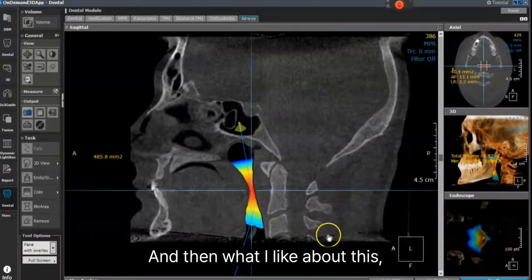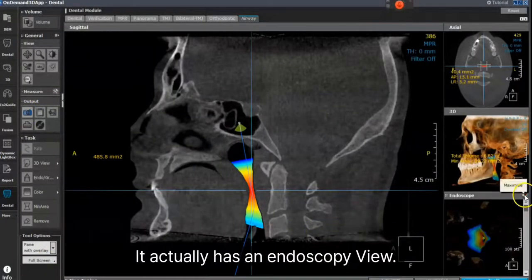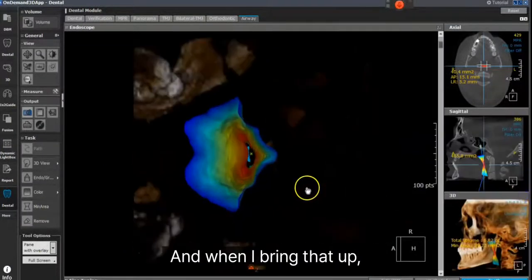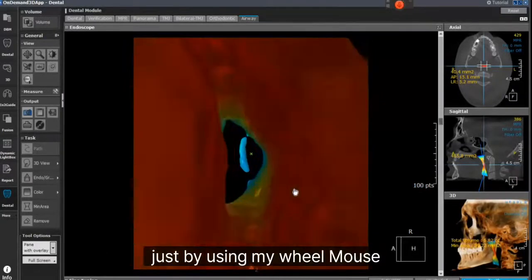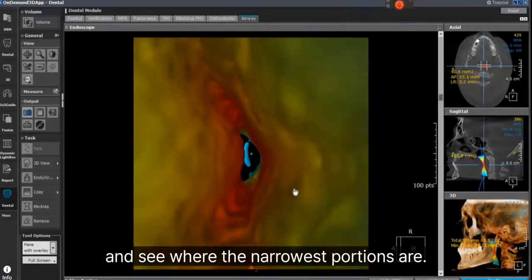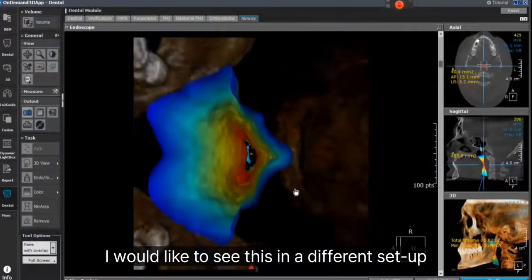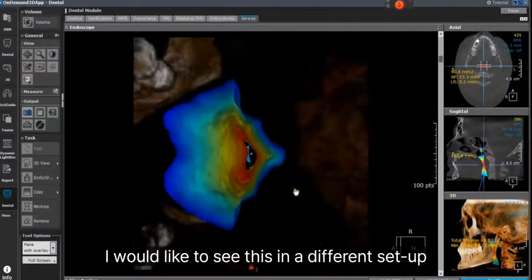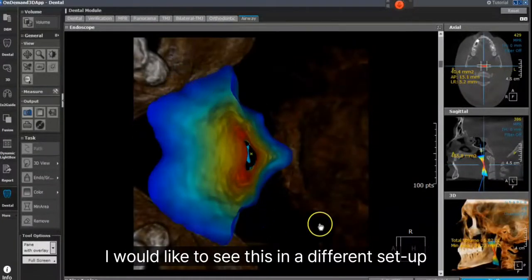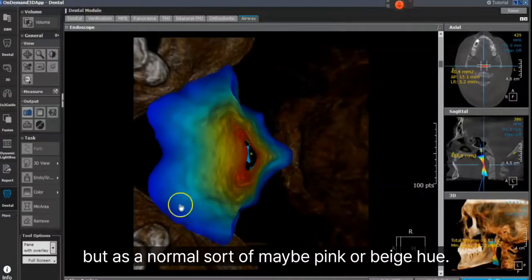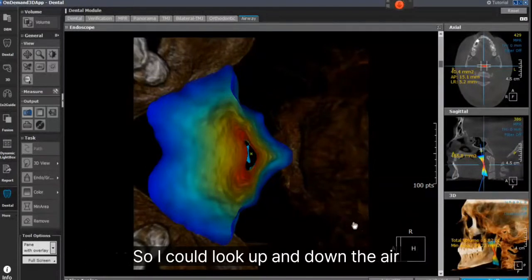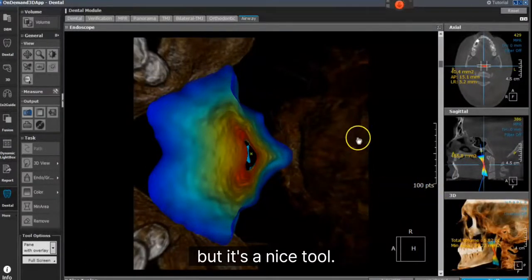What I like about this is it actually has an endoscopy view. When I bring that up, I can actually scroll down through the airway just by using my scroll wheel and see where the narrowest portions are. I would like to see this with the soft tissue shown in a normal pink or beige hue rather than colored, but it's a nice tool.